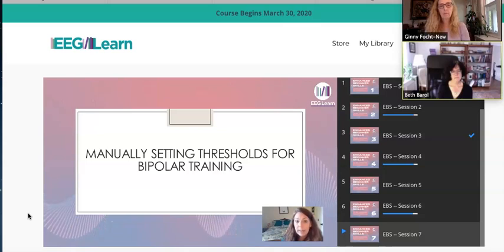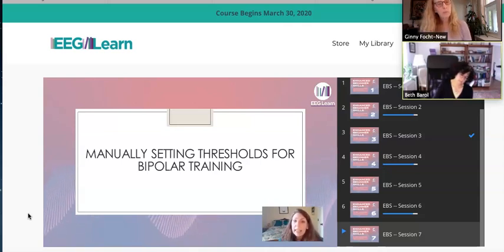But we're going to talk about setting thresholds for bipolar protocols. It's a little bit of a different animal, because we're not looking at the amplitudes of either site with a bipolar protocol. We're looking at the difference between the amplitudes of the two sites that we're training.